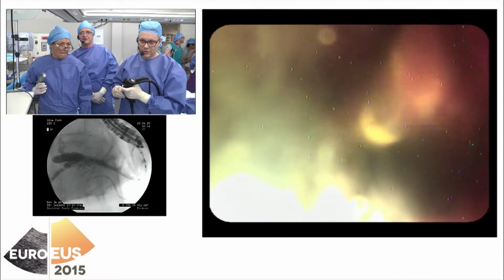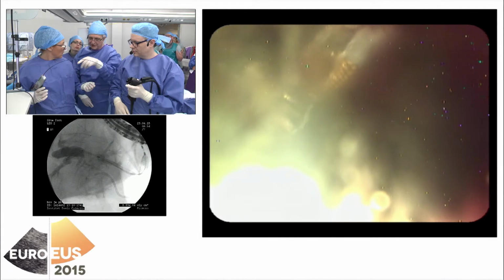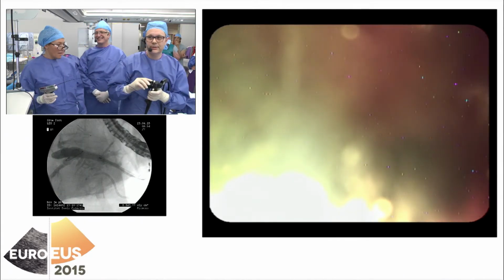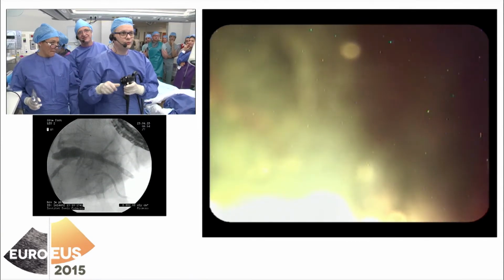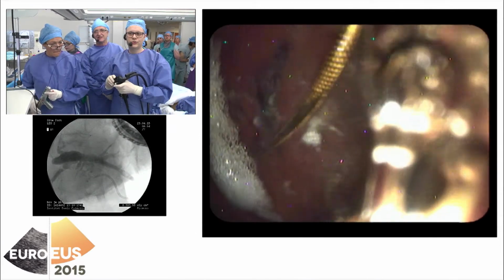Okay, retire l'attachement, la prothèse. Oui. L'attachement. Ah, tu l'as déjà? Okay, the stent is in place. So I will try to avoid putting it too late. I lose the guide wire.